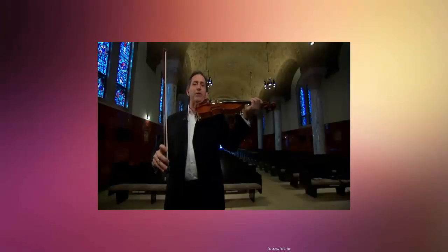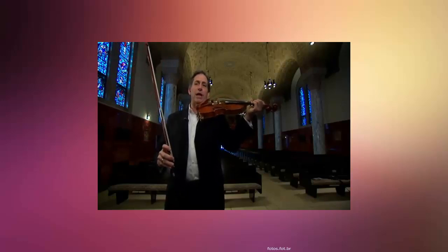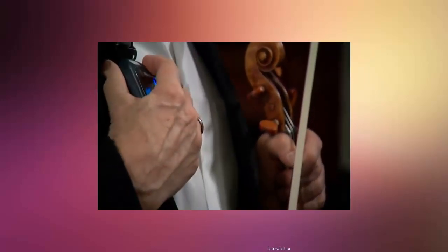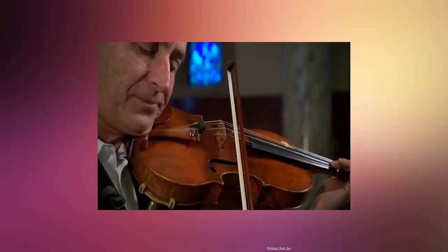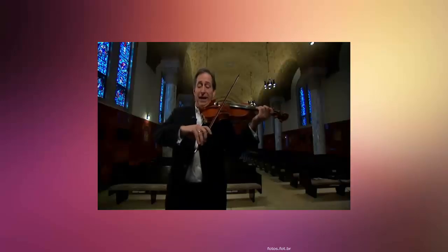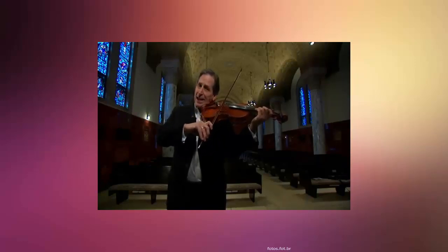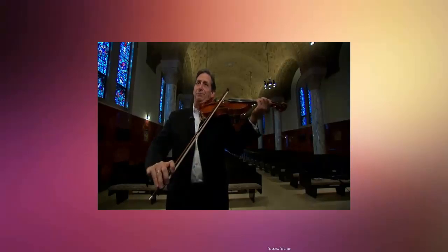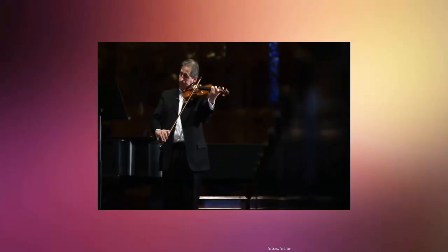"Without the stimulator on, the tremor is quite pronounced." You can see the difference. With the click of a controller, Roger can turn the electrodes on and off. "And that's as smooth of a bow as I can play right now." But when it's on, Roger's mastery of the violin is absolutely clear.